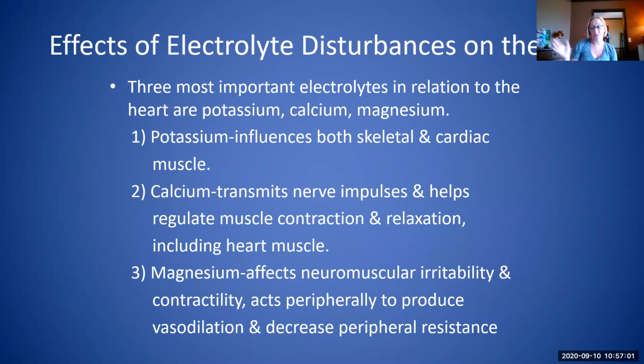Sometimes physicians say that it's torsades, and it's really hard to tell, but it basically looks like a twisting of that QRS complex that's in VTach. It just looks different. I don't even really know how to describe it. Sometimes it's really hard to even judge anyway, with ectopy and stuff that's going on. But if they are experiencing that, then they might give magnesium during a code to help with torsades.